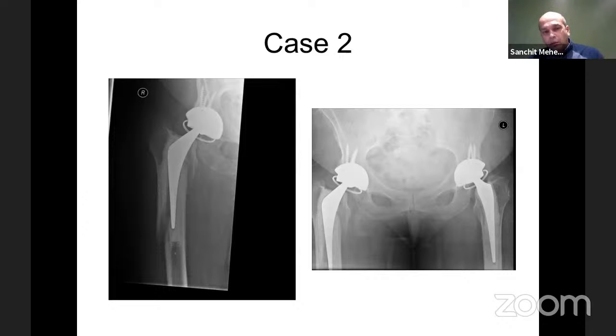So options are, you could fix it, but unlikely to be successful because the implant is now unstable. You could revise and fix it with a similar length, but then plating it distally because the cortices look decent further down the line. What we opted to do in this case is frequently, especially when you have that lesser trochanteric split going up, it's quite worthwhile getting a CT scan to explore the bone stock available. But then we delivered the femur through the fracture site and then lifted it out of the constrained mechanism.